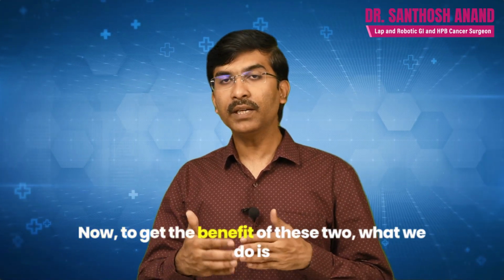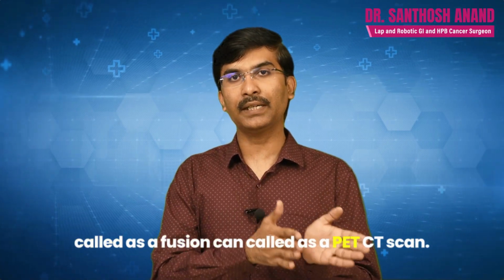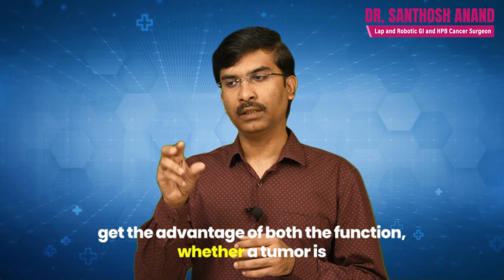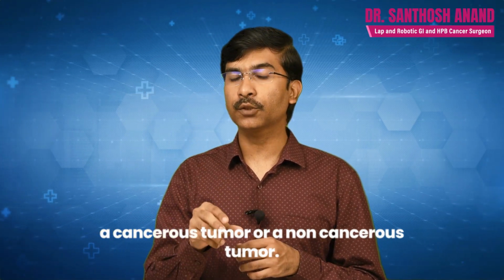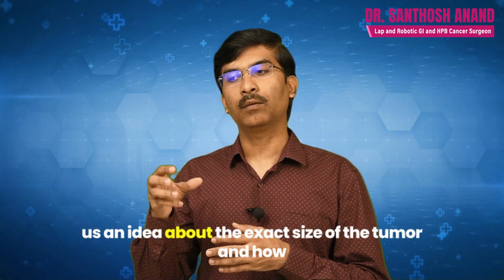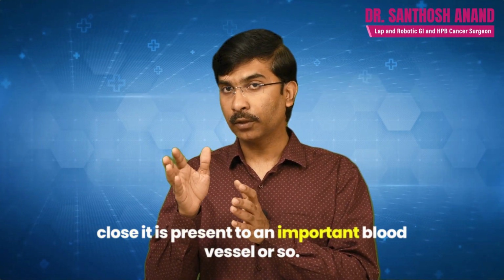Now to get the benefit of both, what we do is called a fusion scan, a PET CT scan. Whenever a PET scan is combined with a CT scan, we get the advantage of both. Whether a tumor is present in the liver, and if it is present, whether it is cancerous or non-cancerous, will be told by the PET scan, and the CT scan will give us an idea about the exact size of the tumor and how close it is to an important blood vessel.